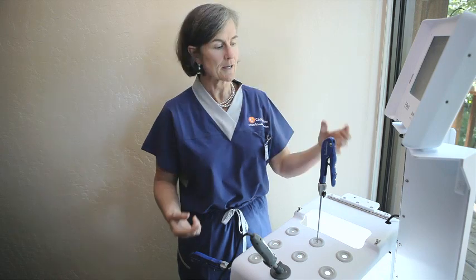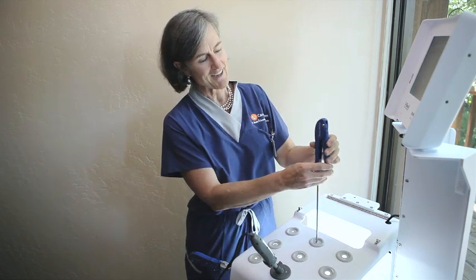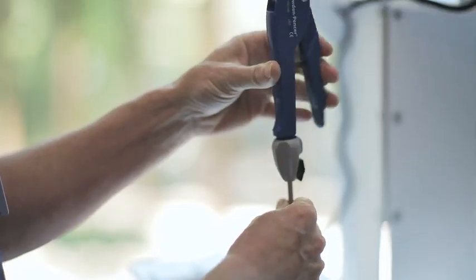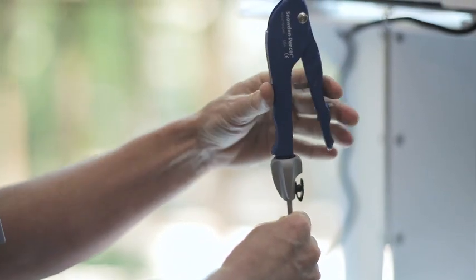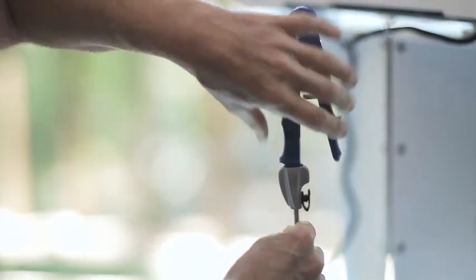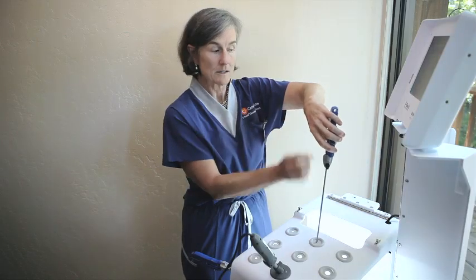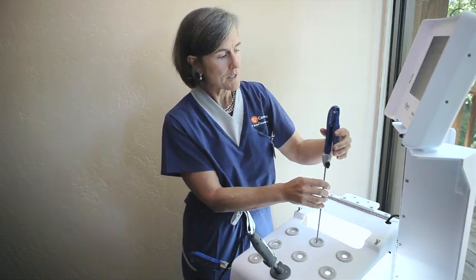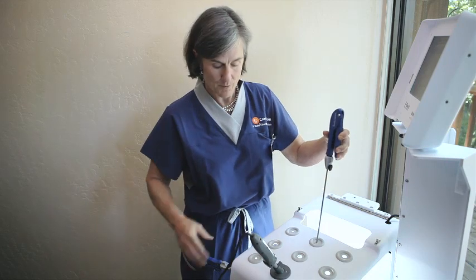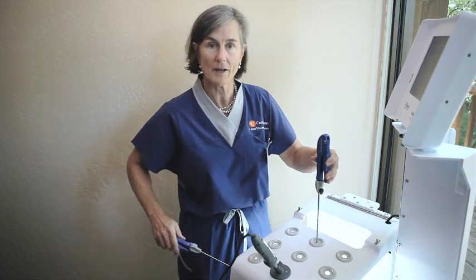My trapezius is not strained and I hold my non-ratcheting grasper in a loose fashion. I hold mine upside down compared to everybody else. I use my CareFusion grasper in a non-ratcheted fashion to pass my knots and my ratcheting hand on the needle driver.